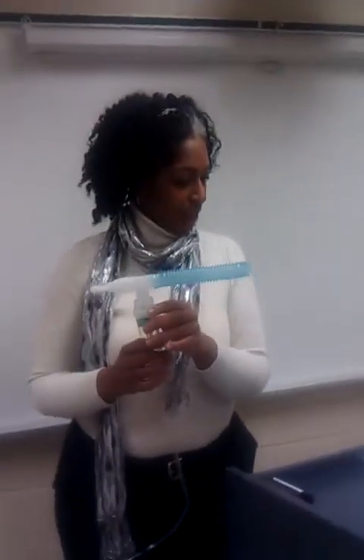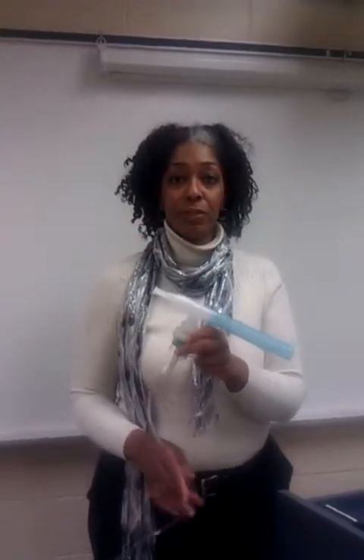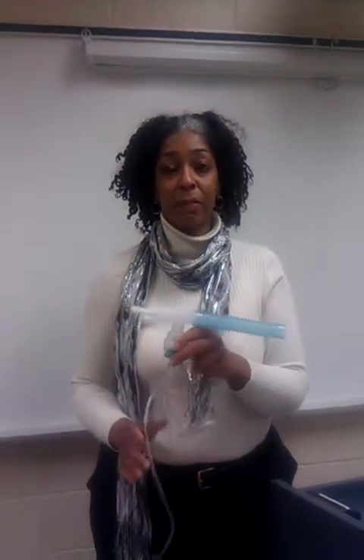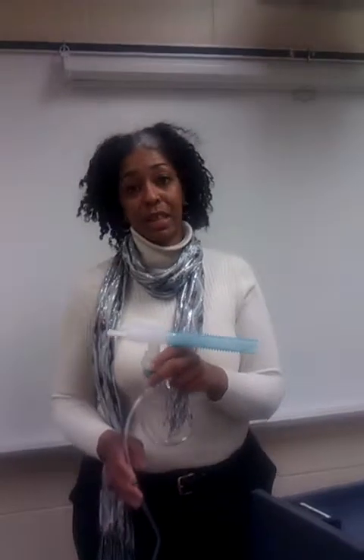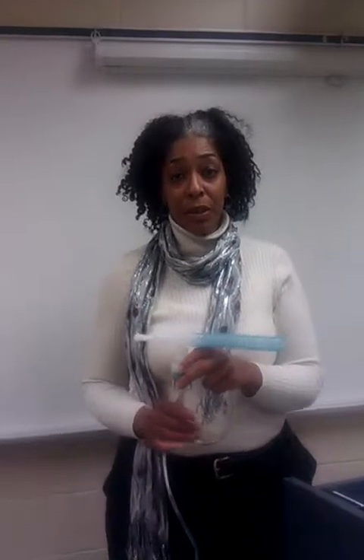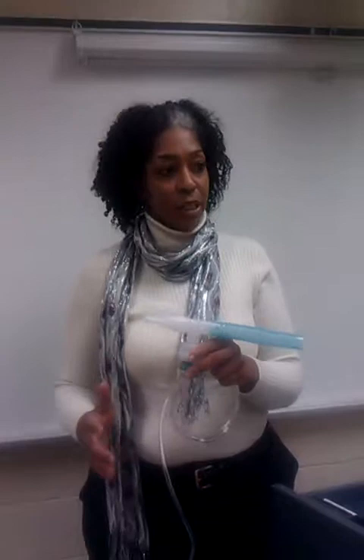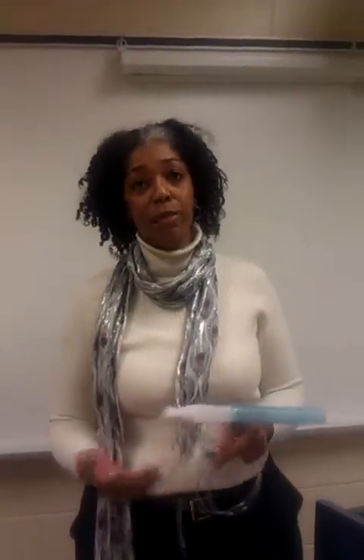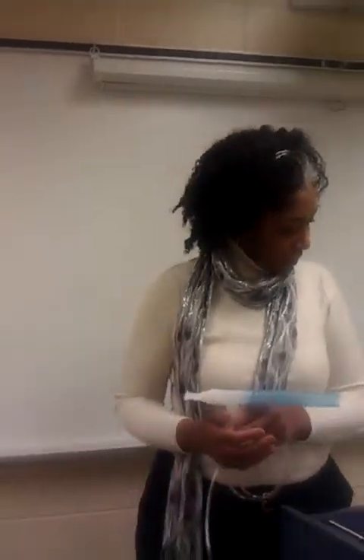The expected outcome of the delivery of the medication is improvement in shortness of breath if the patient was experiencing shortness of breath prior to the breathing treatment, improved breath sounds if breath sounds have been assessed prior to the treatment, and generally the patient will say that they feel better or have less tightness in the chest. Sometimes there are some side effects to these medications, such as nervousness, jitteriness, and increased heart rate. Those side effects generally go away within 5 to 10 minutes after having the breathing treatment.